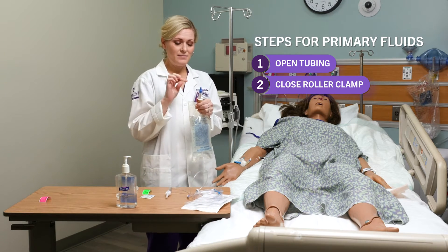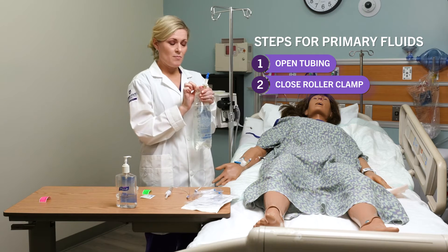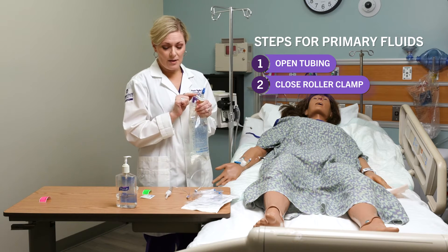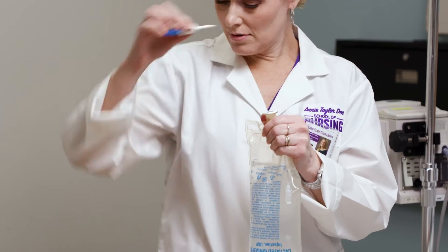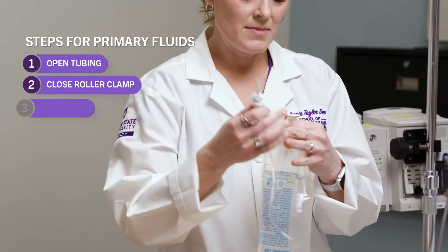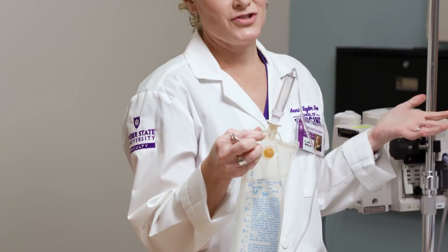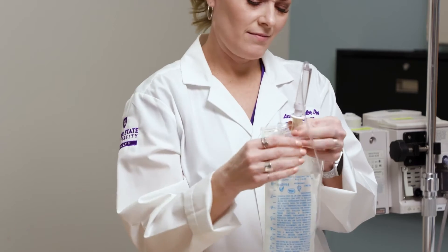Now this bag has already been spiked, so I need to be careful when I open it because it can go all over the place. Bags usually have a little seal when they're brand new, so when you open it out of the package it shouldn't spill. I do want to make sure this isn't contaminated — we have to keep those clean. I'm going to undo my fluids, uncap the spike, and spike my bag. Be careful the spike doesn't go through the side of the bag, because when you hang it, it'll just go all over the floor.